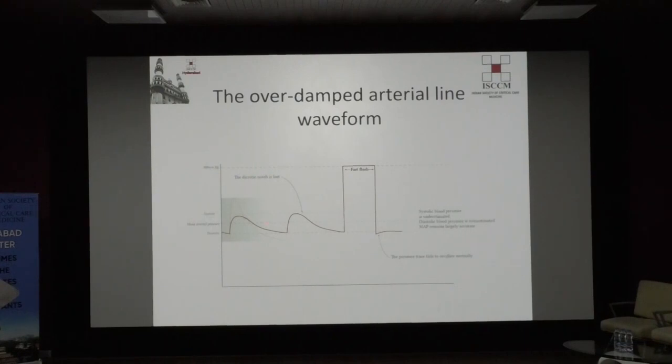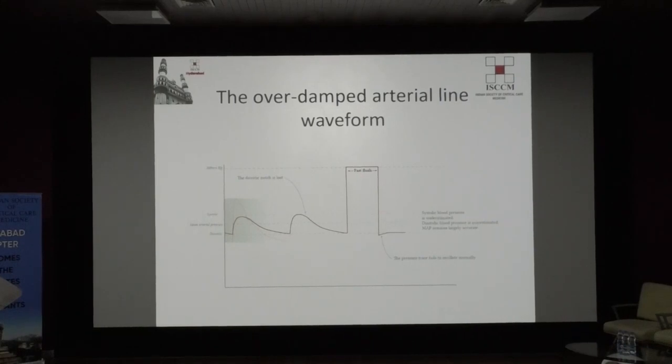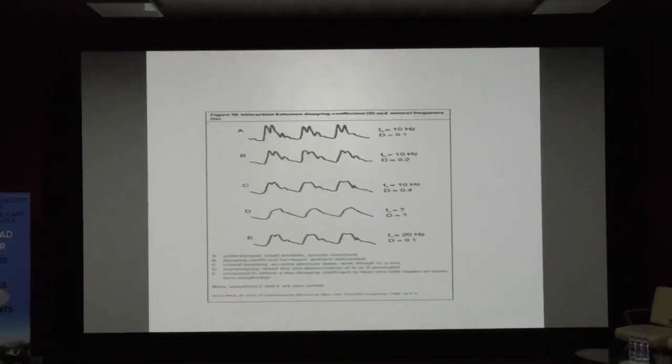What is an overdamped system? You can see the waveform has a loss of dicrotic notch, and when we do a fast flush, no oscillating waves come. So this is how you test for an overdamped or underdamped system at the bedside.